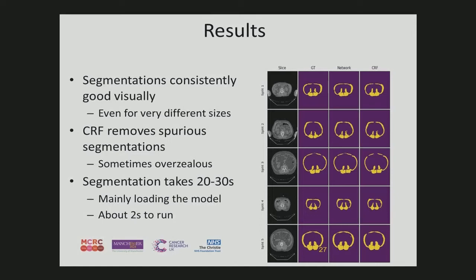And the result is a fairly nice segmentation result, with like a 95% success rate. It's not 100% there, but it's good, and it's very fast. Although we need to do a little bit of work because we are only doing a single slice, kind of for standardization. And what that slice is, we still need to write a network to find that slice. We've now done that manually, which is like 5 seconds work per patient. But still, yeah, that's a bit of a thing.